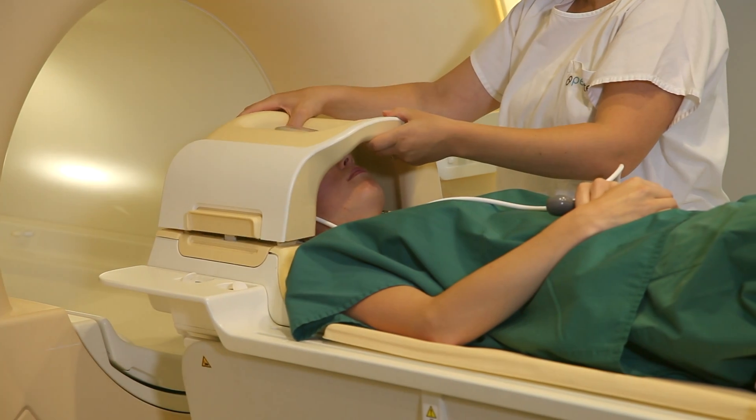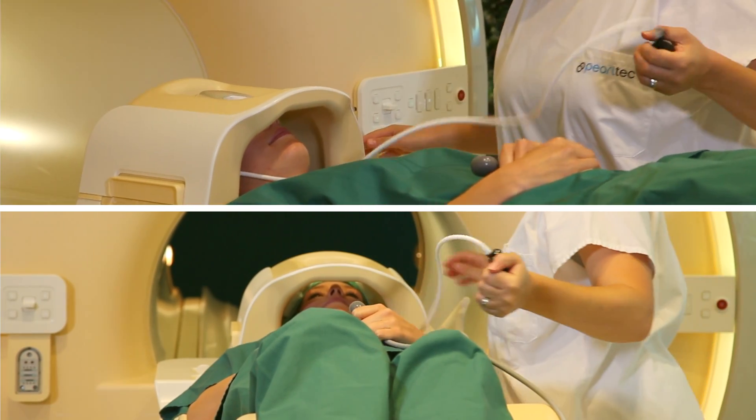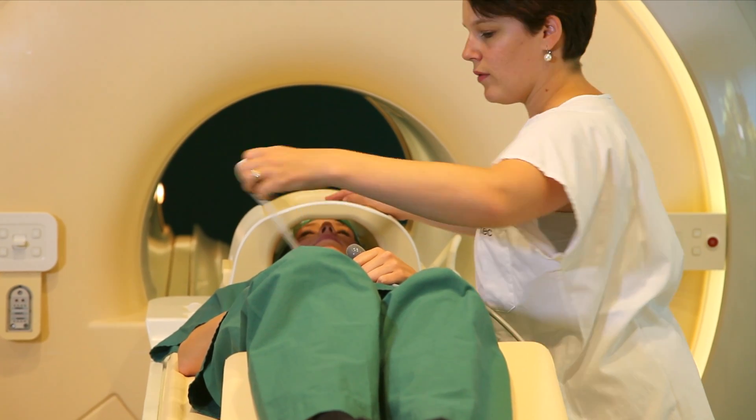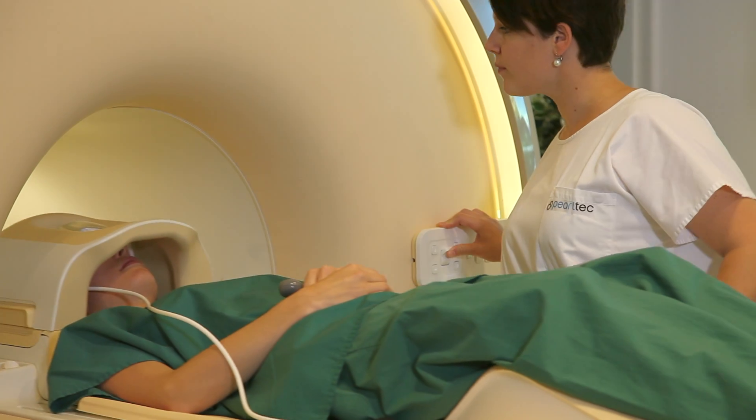Close the coil as usual. Then use the simple hand pump to expand the crania's comfortable positioning chambers. Make sure the air pressure is sufficient to stabilize the patient. Once inflated, place the pump away from the patient call button and the coil.